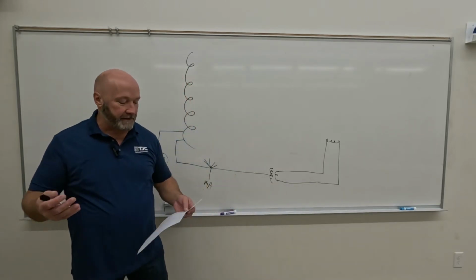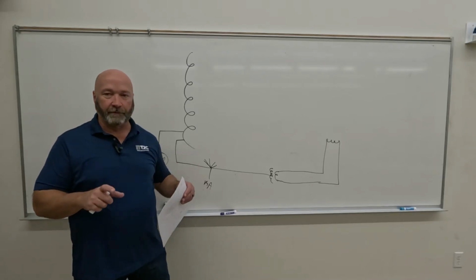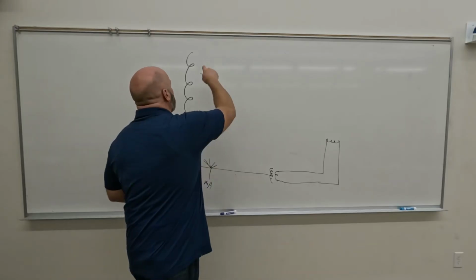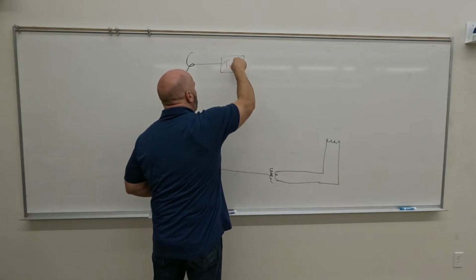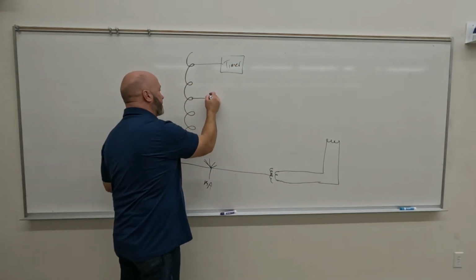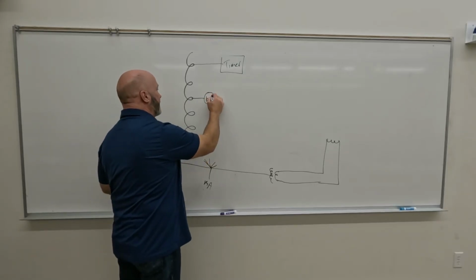So AECs are nothing but radiation detectors that are preset to receive a certain amount of radiation before sending a signal over to the timer circuit, which you'll see drawn somewhere over here on most of your diagrams. We do have one other thing that comes off right here, and that is our kVp pre-reading meter.